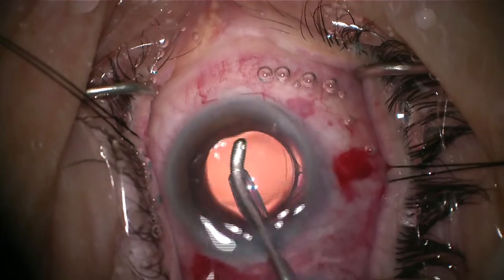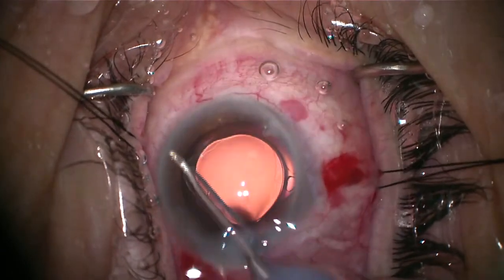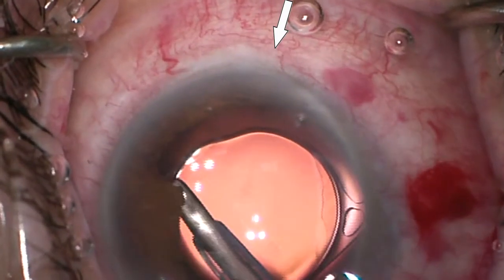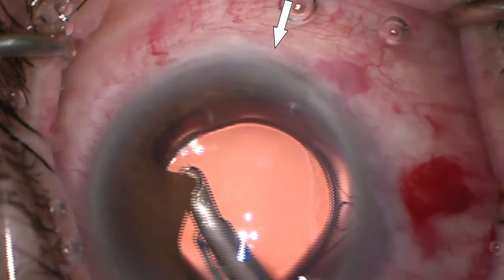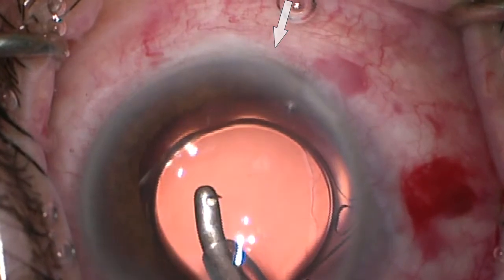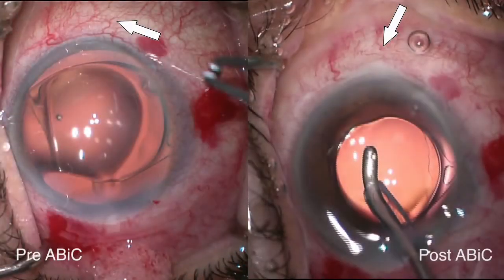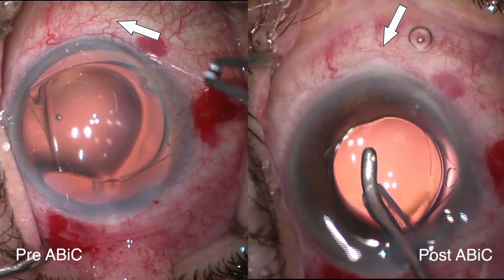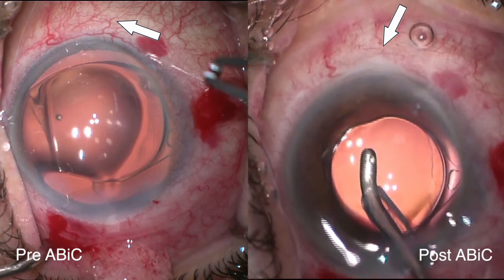And you see here, as we were removing the viscoelastic with our I&A, you see a blanching effect happening on the paralimbal vessels. Here's a slow-mo video — look at that superior vessel just kind of almost disappear with our I&A, showing increased flow. And if you look at these still images on the left — the pre-ABIC versus post-ABIC — you can see the difference in the paralimbal vessels, showing the blanching effect on the right.